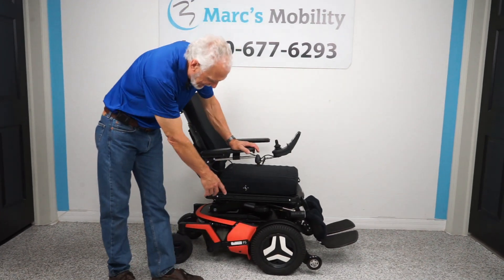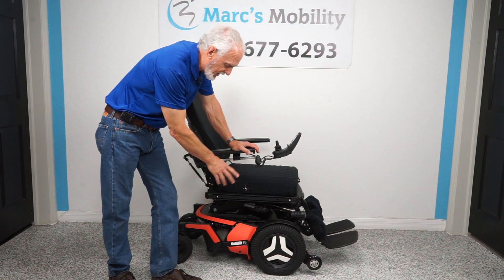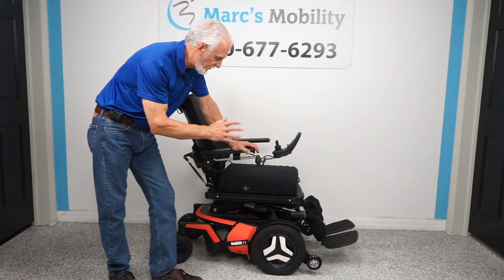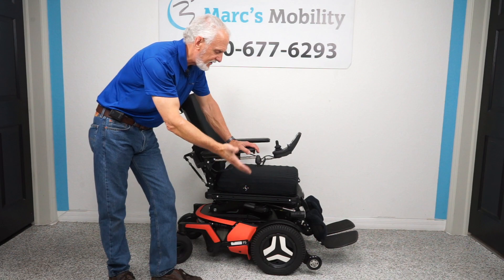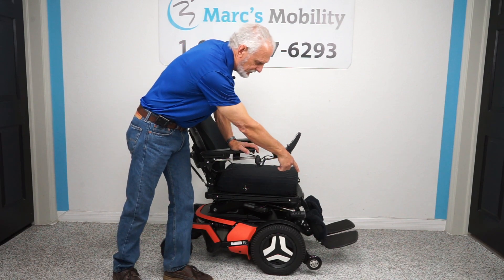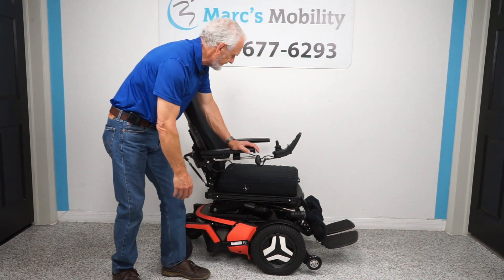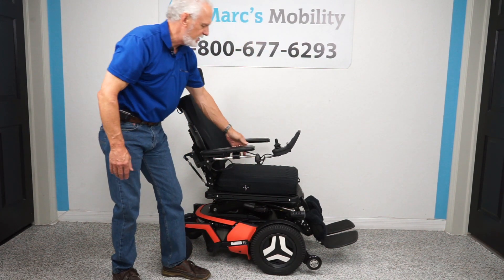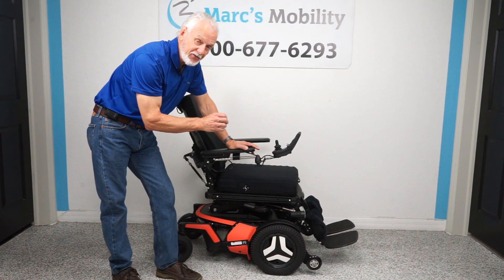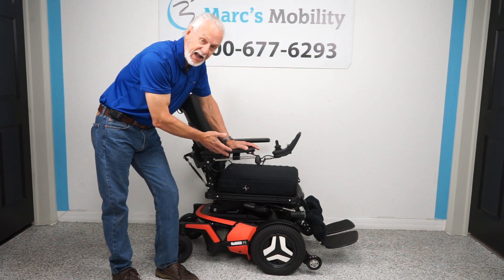So let's recap: this is a Permobil F5 power chair with approximately 415 miles. We replaced the two motors — $1,600 in new motors, which is the most important part. It has the 14-inch seat lift, electric tilt, electric recline, electric feet, custom calf pads, swing-away joystick, factory headlights, ROHO cushion, flip-up arms, suspension, and solid tires. If you're looking for an F5 but don't want to spend top dollar, this one is worth a look.